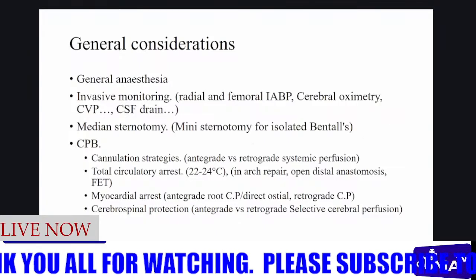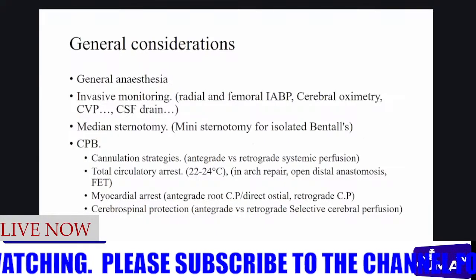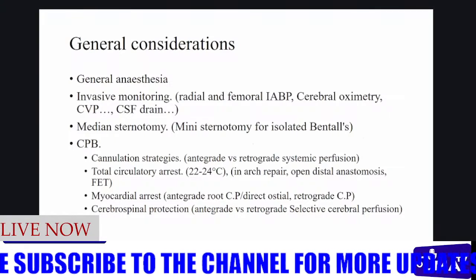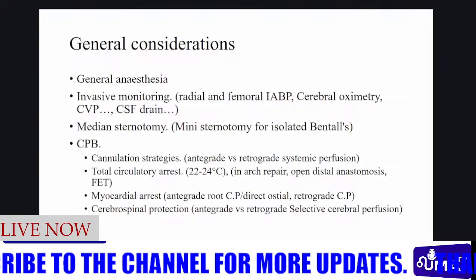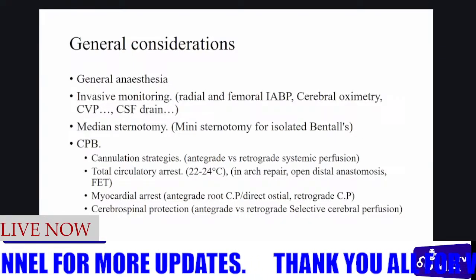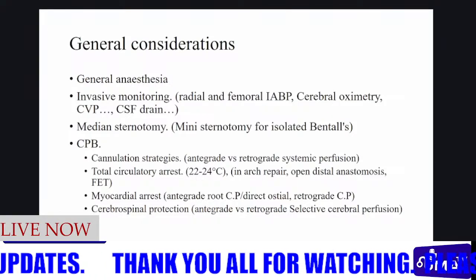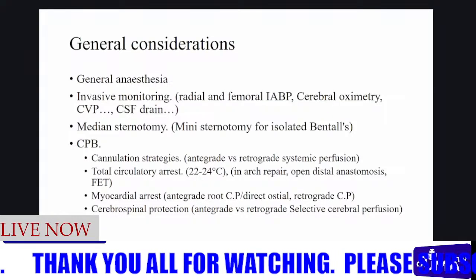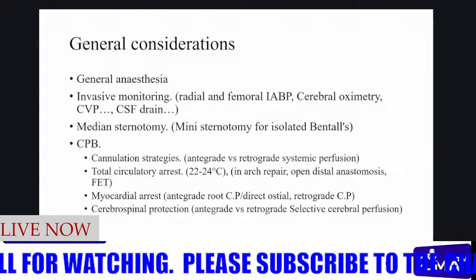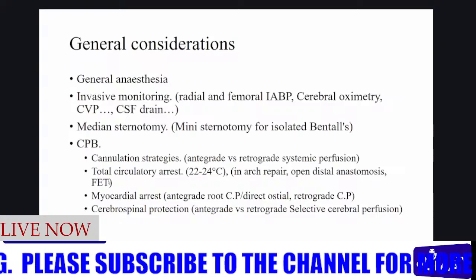This is more like open heart surgery, but we are doing surgery on the aorta, right? The aorta is what carries all the systemic circulation, and yet it is what you're going to operate. So what happens to the systemic circulation? Okay? You're going to open the aorta, what happens then? How are the other organs getting blood? So this is where we employ cardiopulmonary bypass.